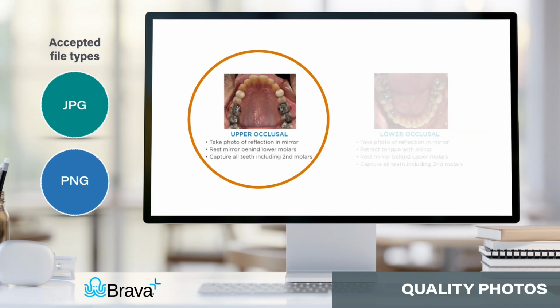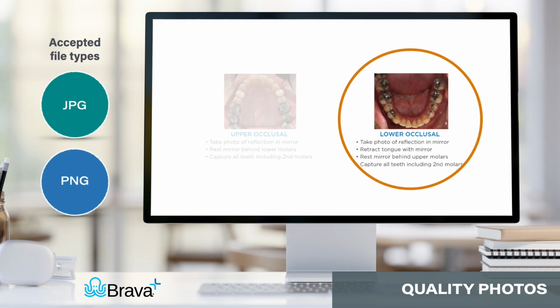For the upper occlusal, take the photo using the reflection in the mirror by resting the mirror behind the lower molars. Be sure to capture all teeth, including the second molars. For the lower occlusal, take the photo using the reflection in the mirror by resting the mirror behind the upper molars. Retract the patient's tongue using the mirror. Be sure to capture all teeth, including the second molars.